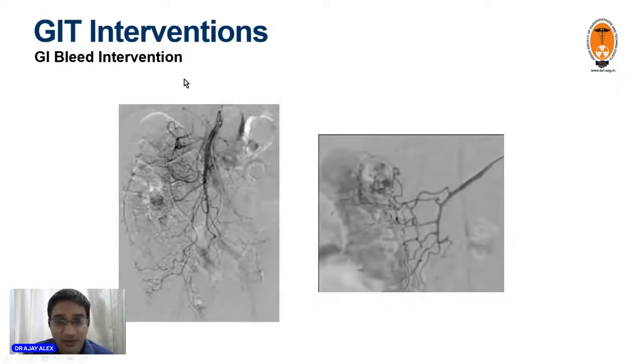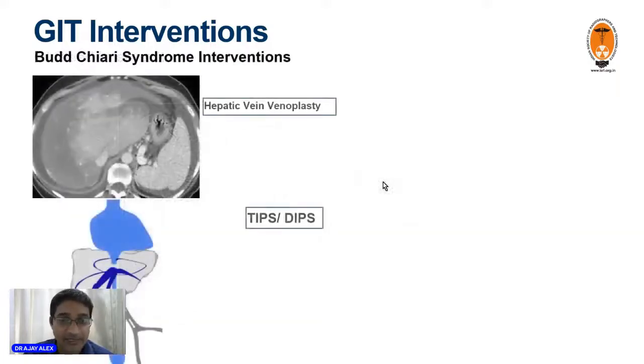In addition to aneurysms in relation to the peripancreatic bed, you can also detect bleeds that are happening into the colon or into any part of the small intestine, as in this case, from a branch of the SMA. This was also embolized with PVA particles, thereby preventing further anemia in these patients.